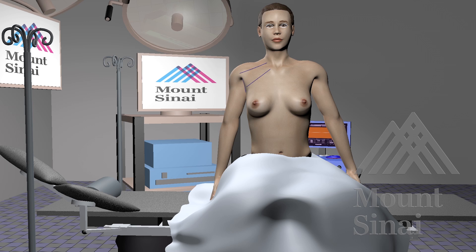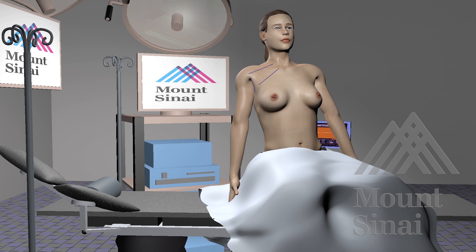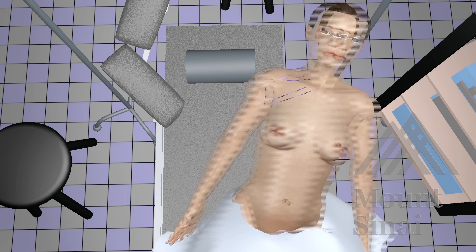Once the patient has been pre-marked, place the patient in the supine position on the operating table.